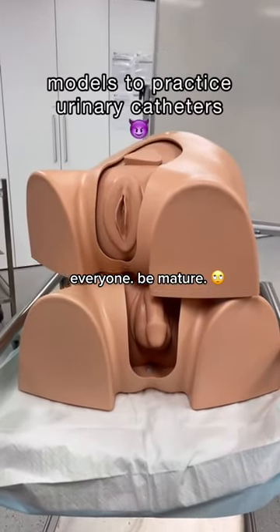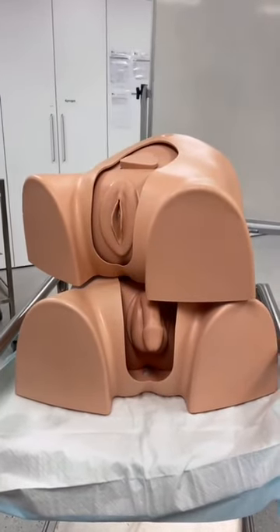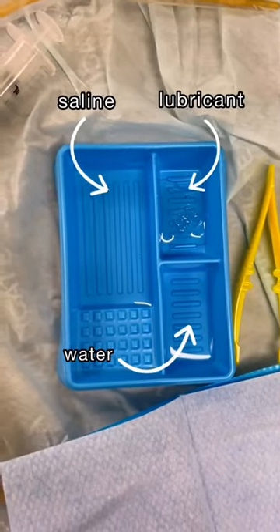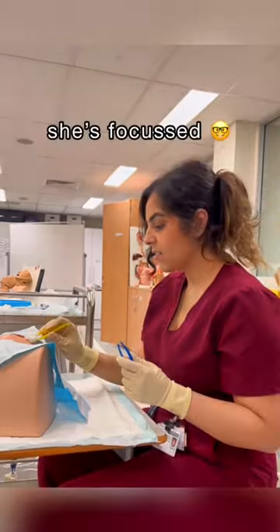I just learned how to insert urinary catheters in med school, so I'm going to show you guys. Here's me being a professional and getting the equipment ready. I've grabbed some saline to clean the patient, some water to inflate the balloon, and some lubricant.